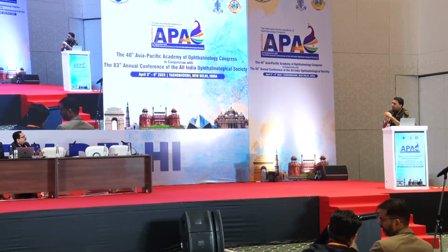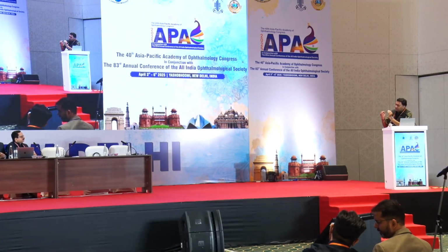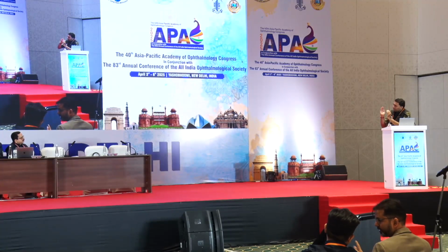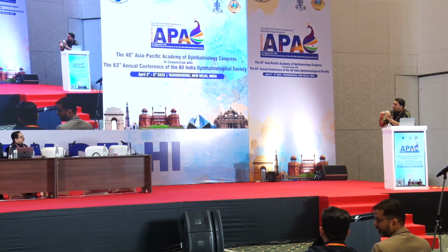So the aberrations are already on the cornea. Whatever we were learning in wavefront-guided, there's hardly 4% of patients who had RMS more than 2.5. What happens is when you're doing a topo-guided Contoura, you're correcting the cornea beautifully, but the lens is not factored in. When you're doing this procedure, it takes into account the accommodation change.